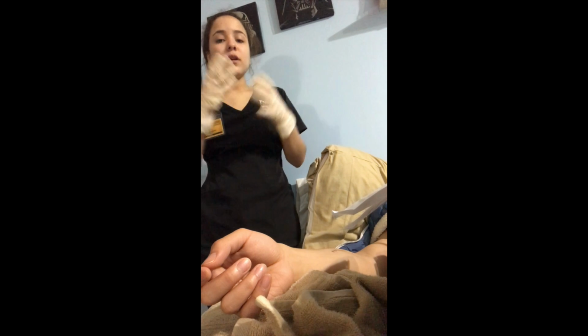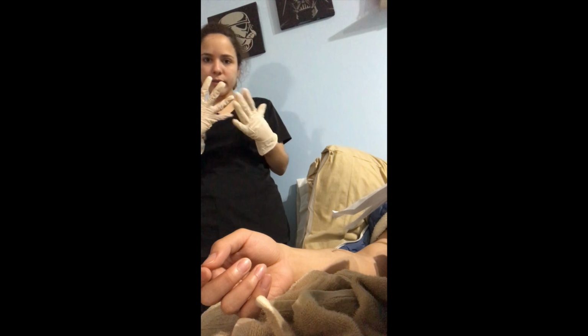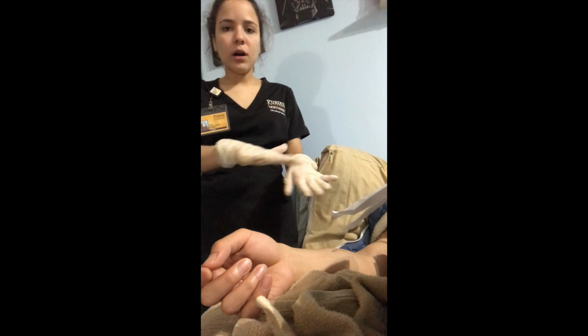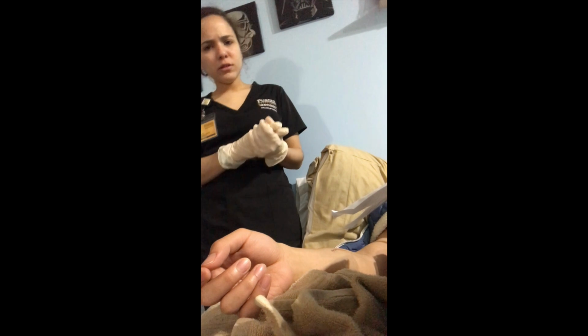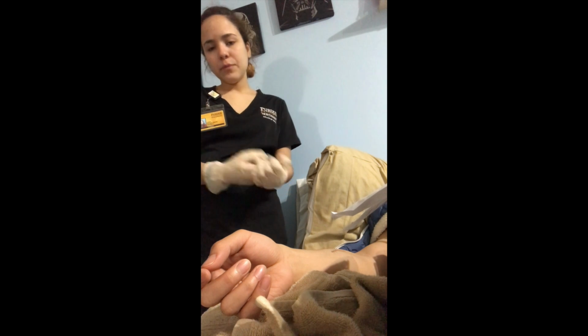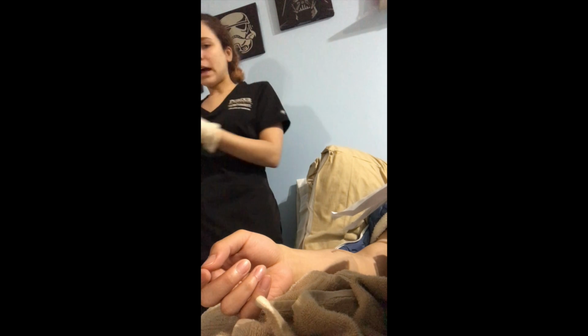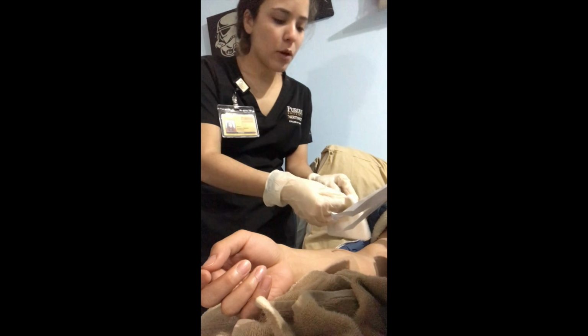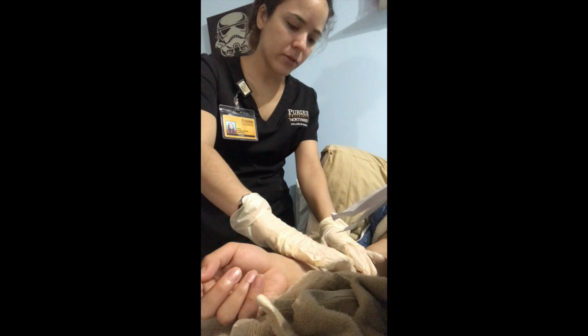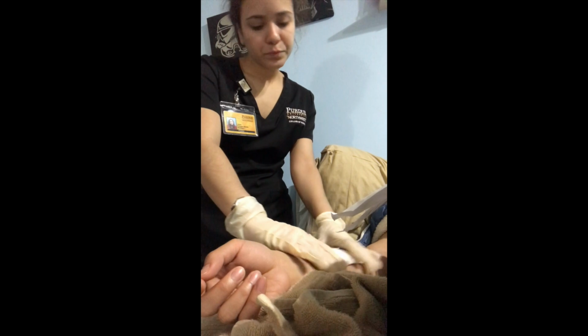So I have put on another pair of sterile gloves, doing the same procedure I did before, and I have cleaned the wound. I have put any medication that was necessary for the patient, and now I'm going to put on a new dressing. So I have my new dressing for my patient, and I'm going to put it at least 1 inch away around my wound.